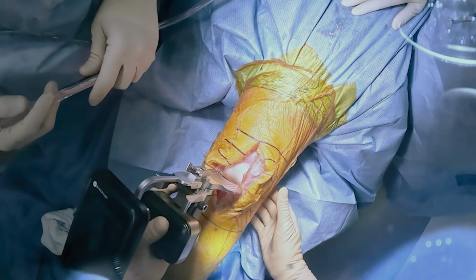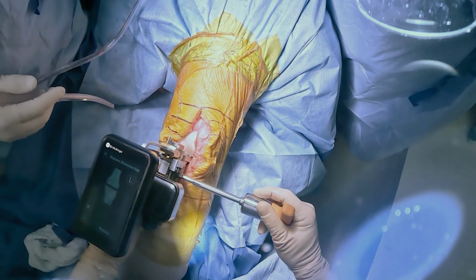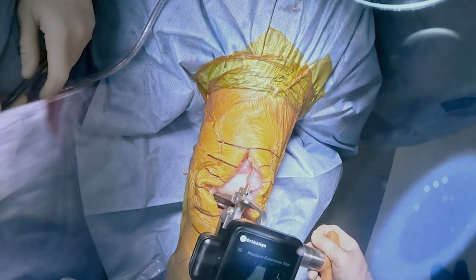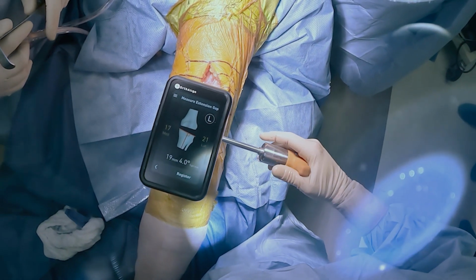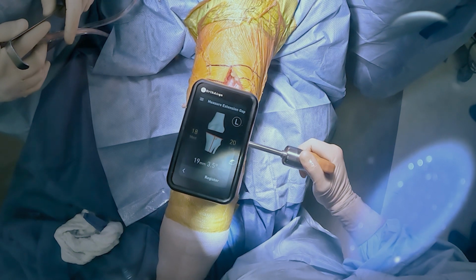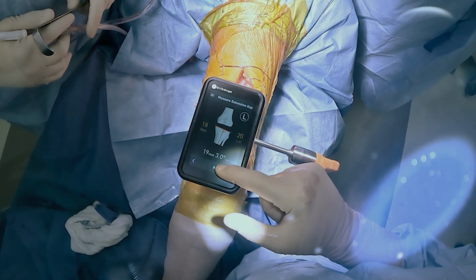After I make my distal and proximal cuts, the Lantern allows me to gap balance appropriately. Previously, I would use a spacer block and go by feel with this step. However, this actually quantifies the numeric values of the medial and lateral gaps, which gives me a better idea of what I'm working with. In this case, the medial compartment is tighter than the lateral compartment, approximately 18 to 20, which signifies with me that I can maybe release a little bit more medially, and I generally do this earlier on in the procedure with the Lantern technology.